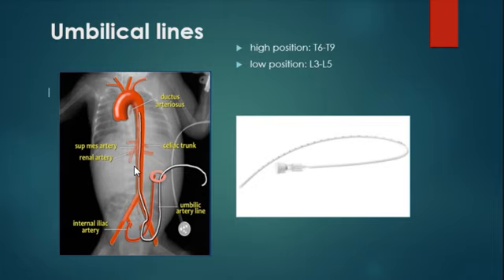The purpose of this is to avoid as many vascular complications as possible, because this is where we might have complications. So either it is in a high or a low position.